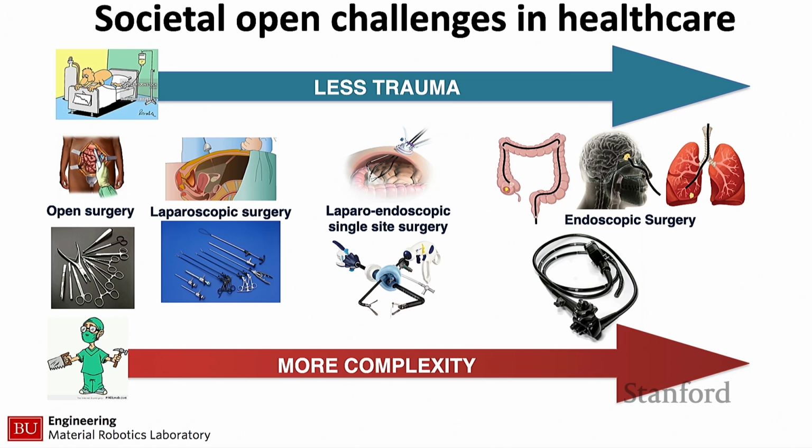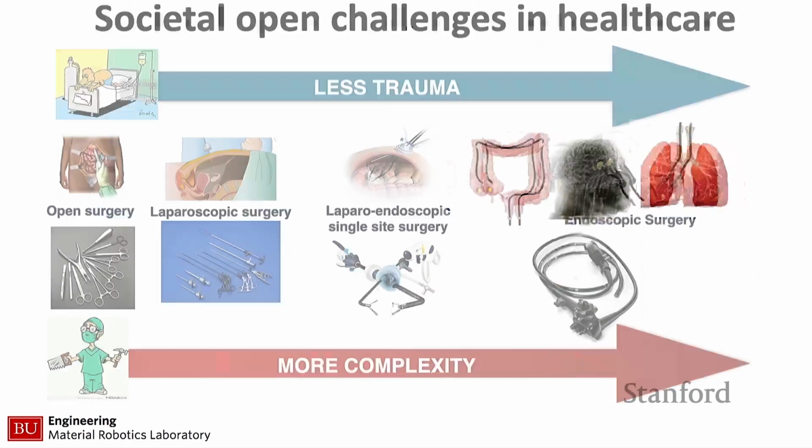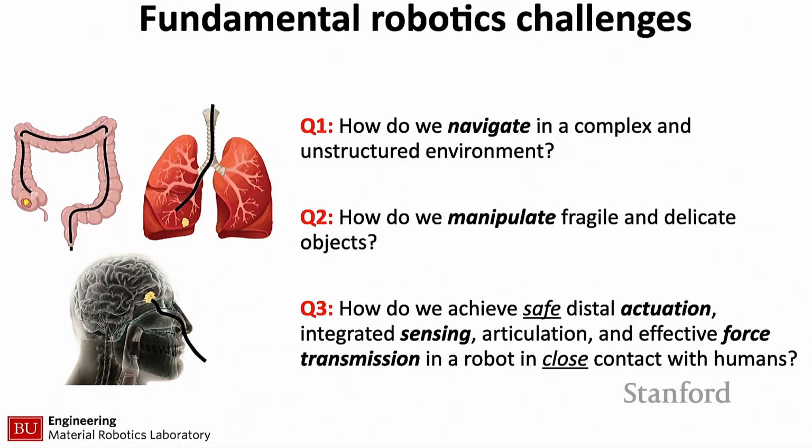So you have to imagine, if you want to control a hose and you want to control the flexible tip of that instrument, it's really difficult to do when you have such long, flexible instruments like endoscopes, for example. And so these clinical applications, these medical applications, I would say, really give us the opportunity, these are case studies that are really good for roboticists like myself, because we are really interested in solving fundamental questions and open challenges in robotics associated, for example, with robotic navigation, robotic manipulation.